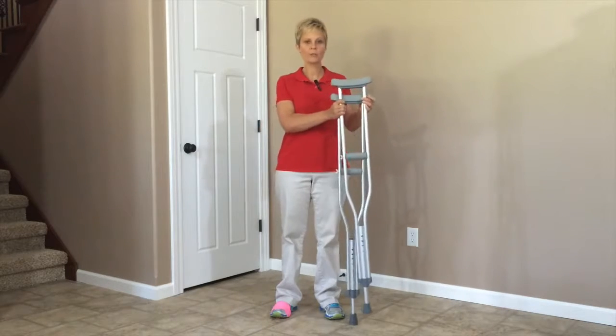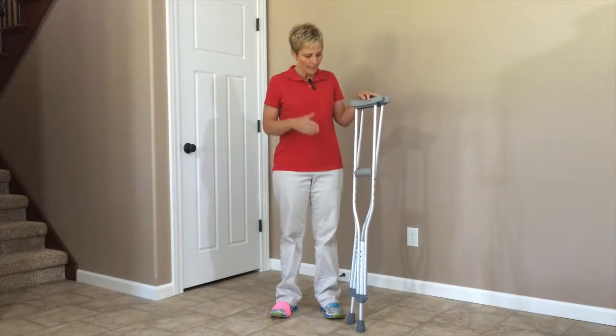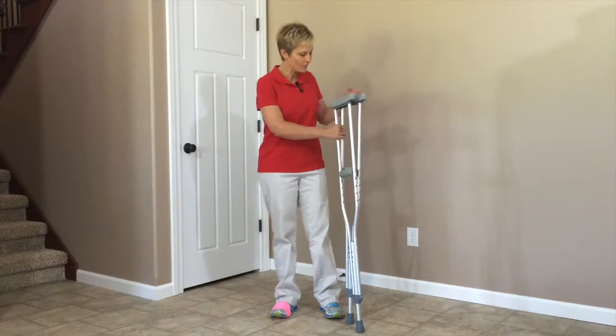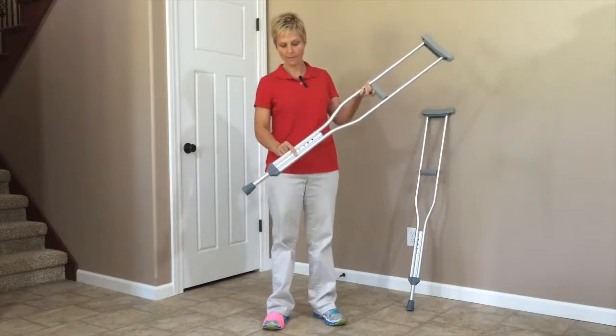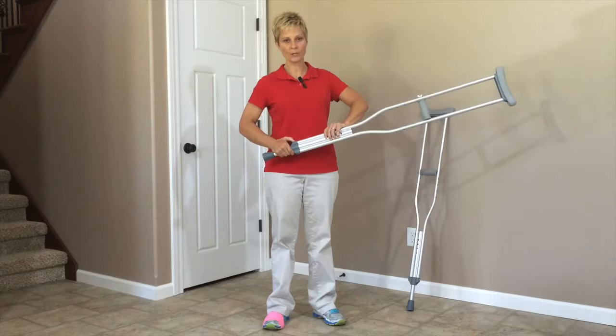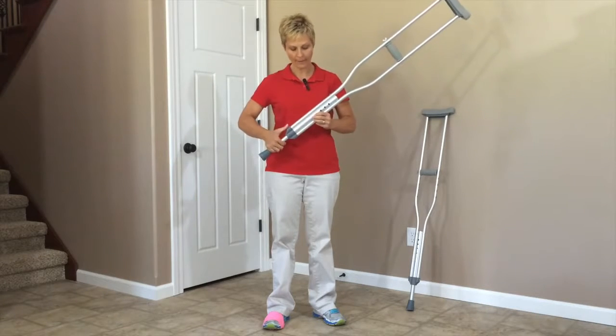I've got a standard set of crutches here. These are aluminum — that's what most of them are made of now. You have two adjustments when you're looking at crutches that you need to pay attention to. The first adjustment is in the height at the bottom, which has the push button adjustment kind of like your walkers and your canes do. That's going to be at the bottom of the crutch.